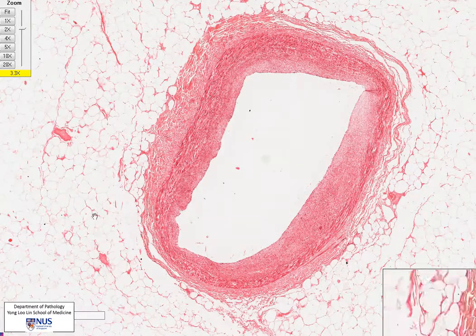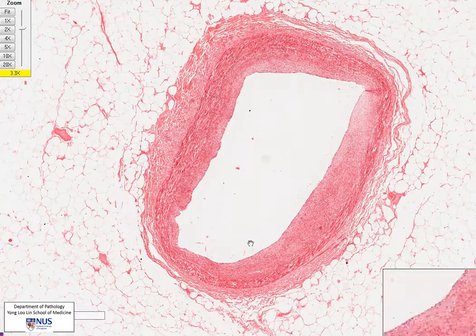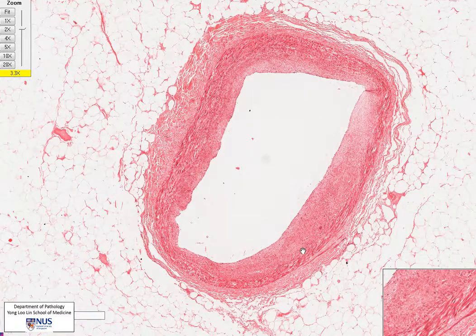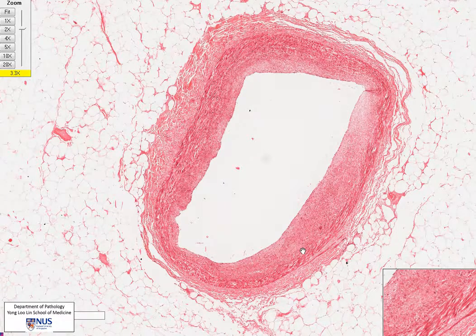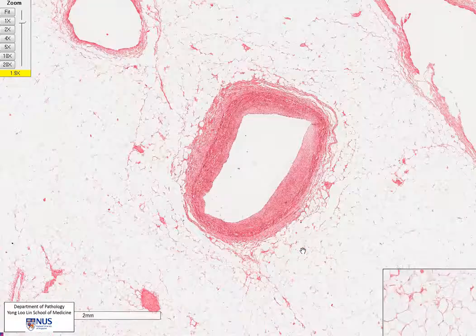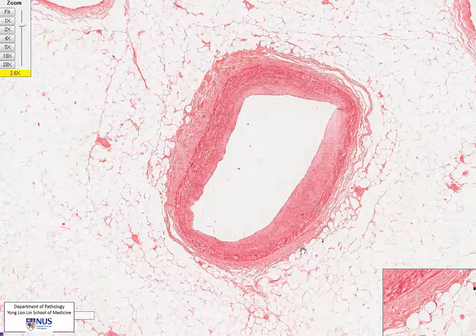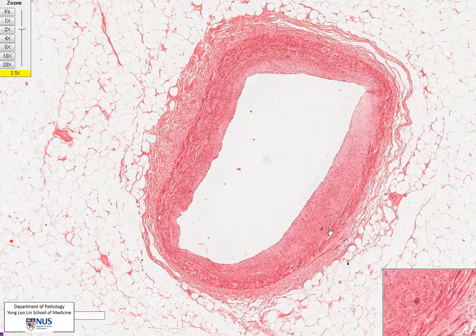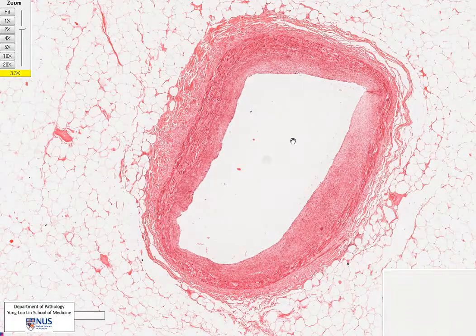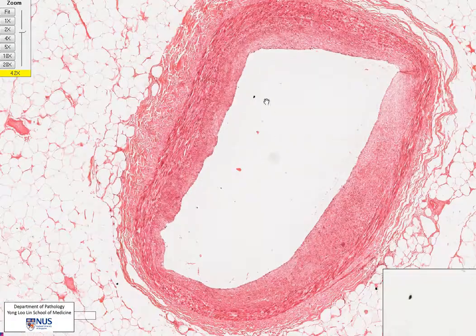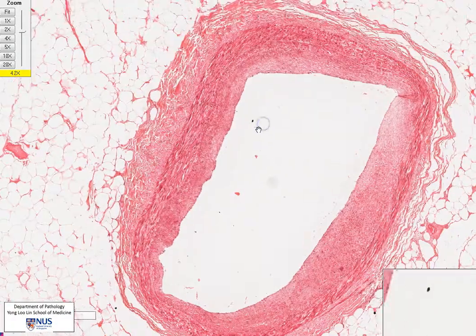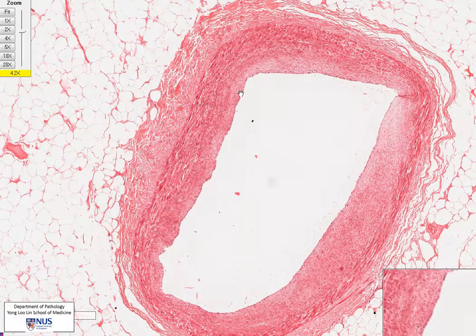Hello, we're looking here at a microscopic section of one of the coronary arteries embedded within the epicardial or pericardial fat. So let's just very quickly recap the layers of the normal vessel wall.